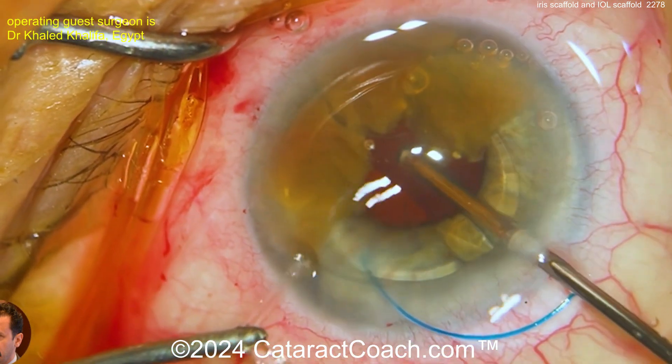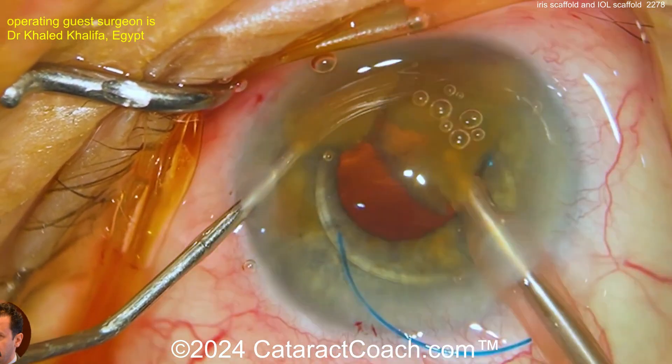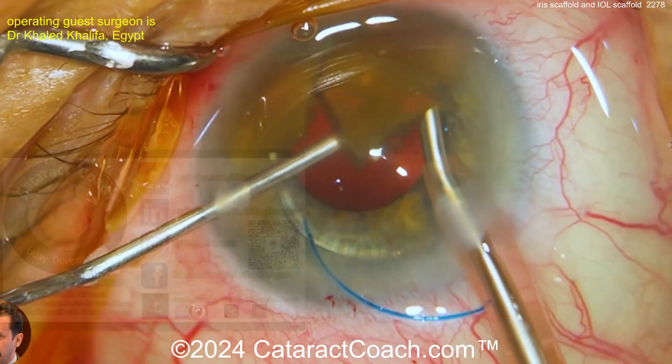Now going inside here, looks like there's an anterior vitrector. Now going back to the phaco probe. This is coming to be a neat case — that's a beautiful technique.